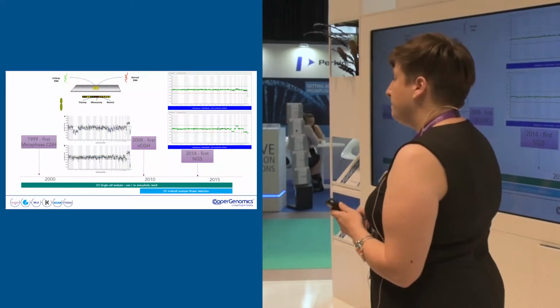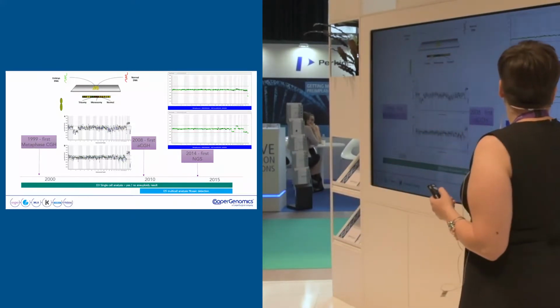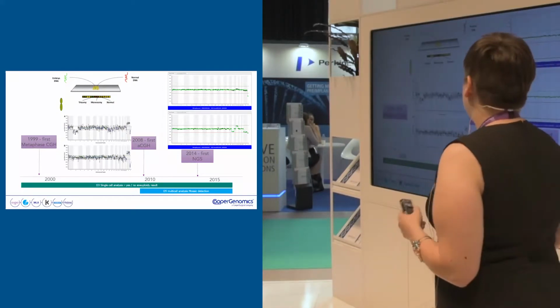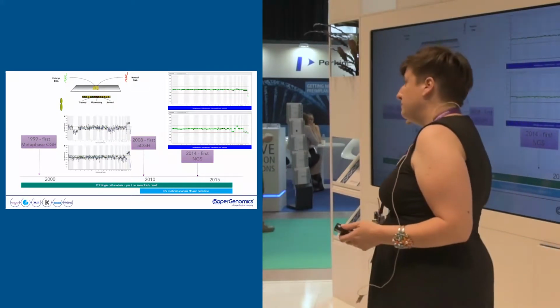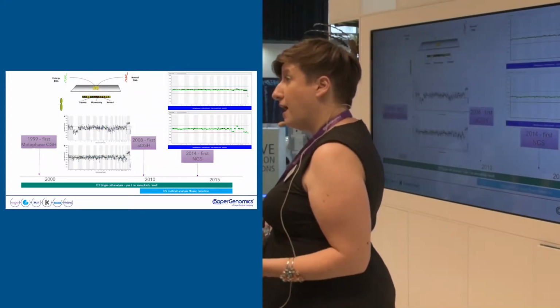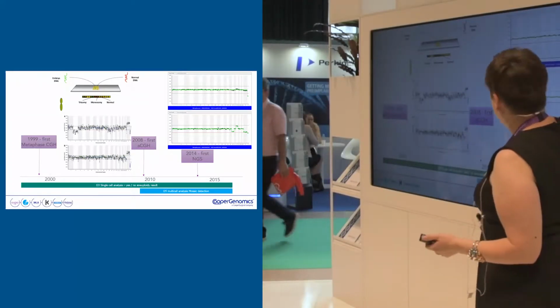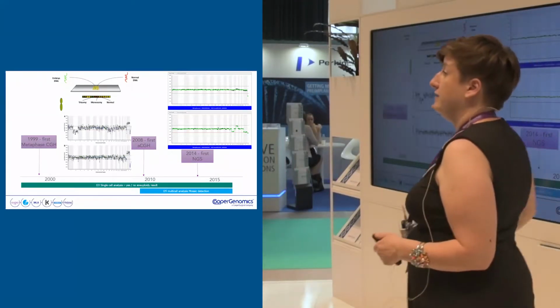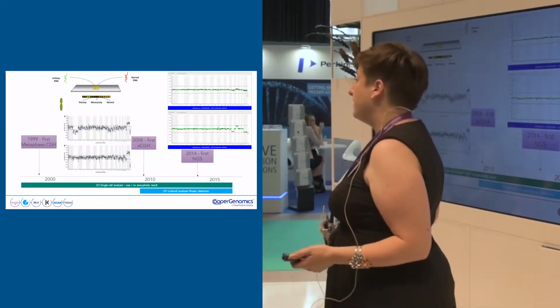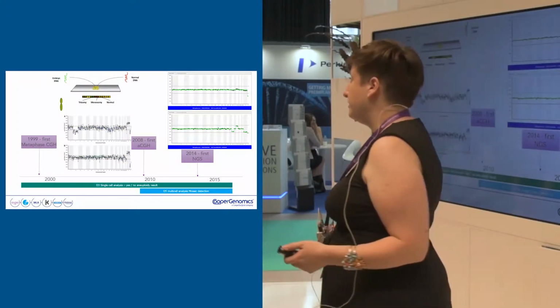But a byproduct of starting to use next generation sequencing was that we could then start to see mosaicism. Because we're testing more than one cell, we'll see that some cells may be normal, some cells may be abnormal. And that's when you get this picture here, that rather than hitting the green line or the red line, it's somewhere in between. And that indicates to us that within that sample that's been tested, there are some euploid cells and some aneuploid cells.